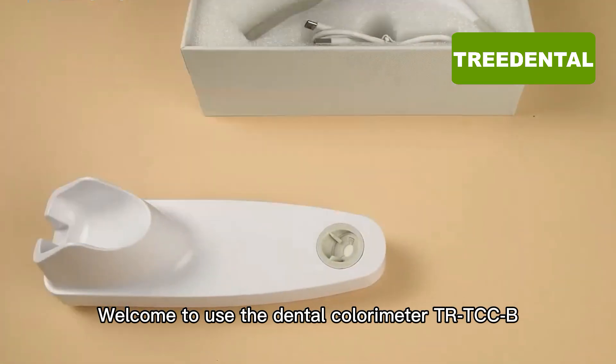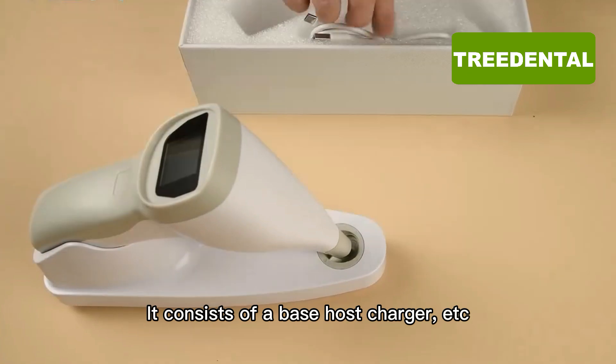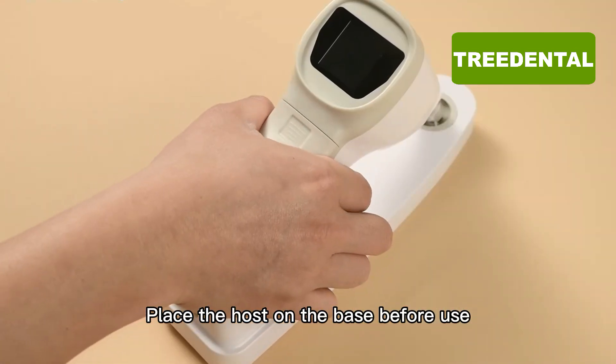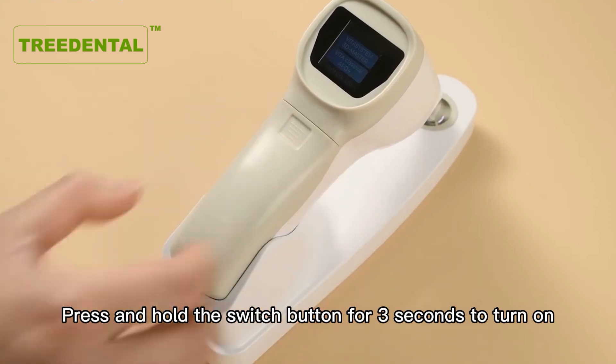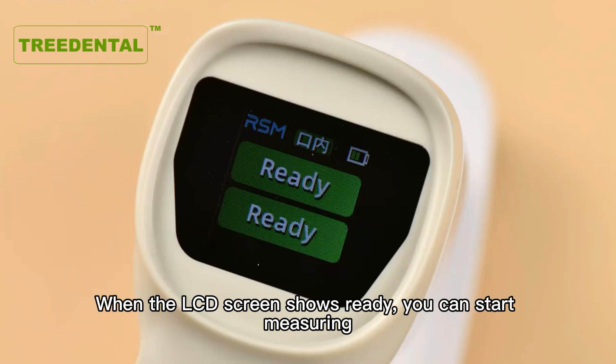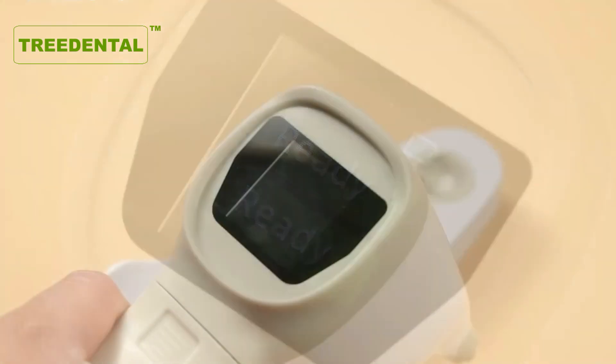Welcome to use the Dental Colorimeter TRT-CCB. Place the host on the base before use. When the LCD screen shows ready, you can start measuring.